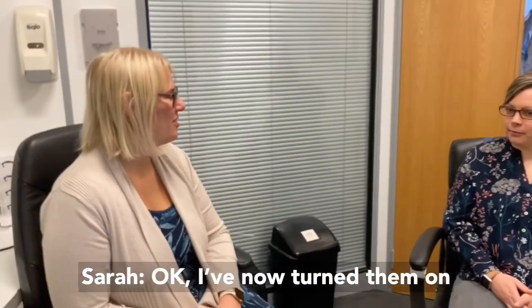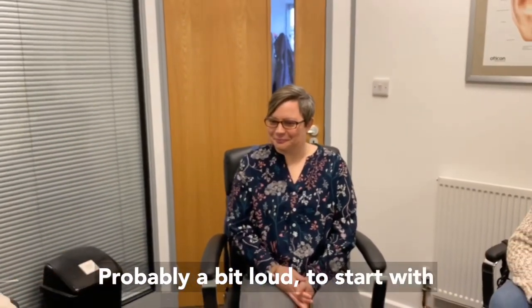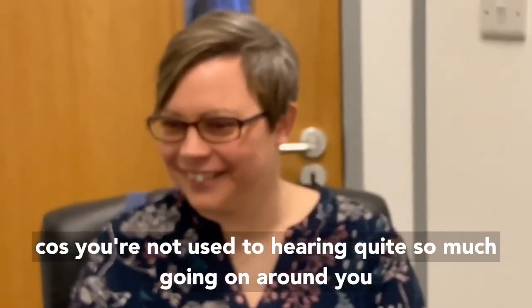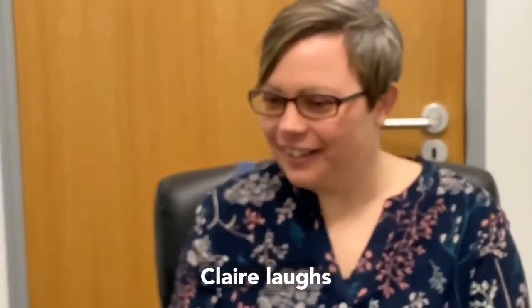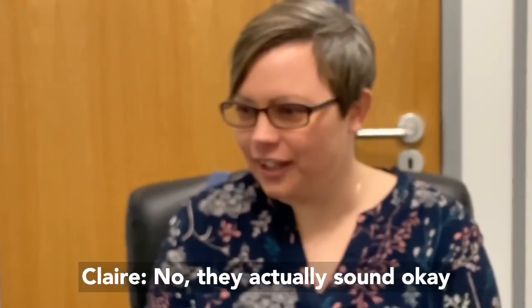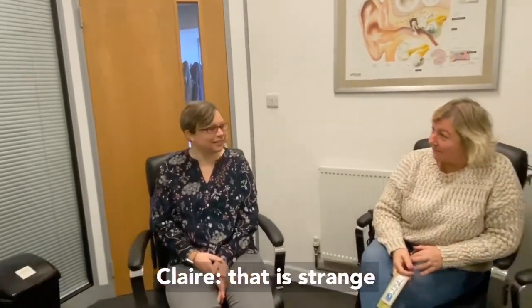Okay, I've now turned them on. How does that sound? It's probably a bit loud to start with because you're not used to hearing quite so much going on around you. Well, you sound different. Do I? In a good way? Yeah. Okay, do you want me to turn them down a little bit? No, they actually sound okay. That is a completely different sound. Yeah. That is strange.